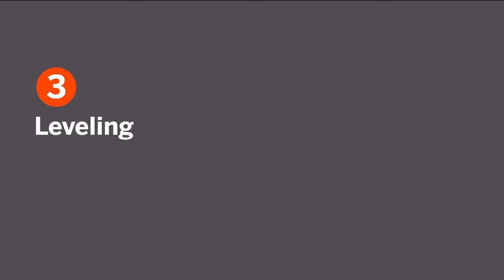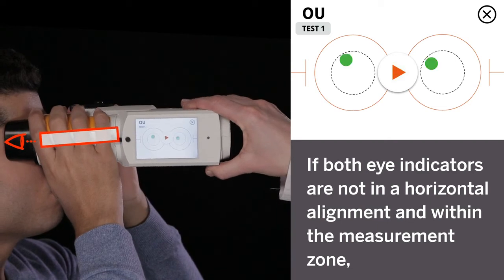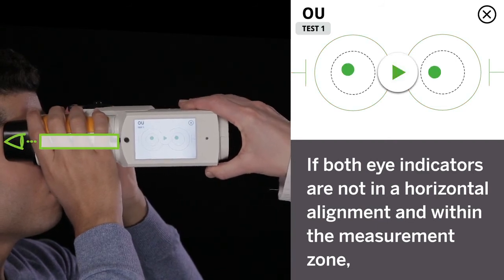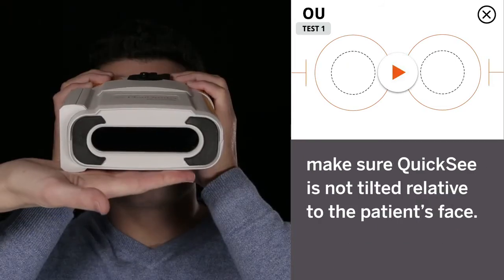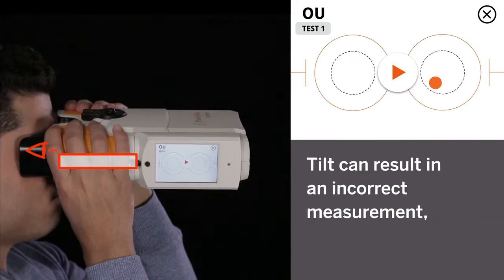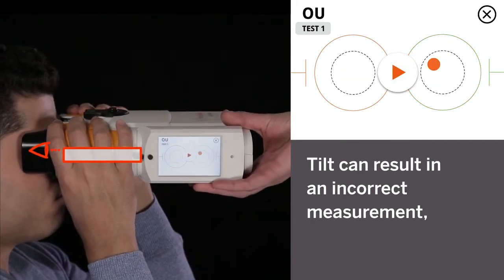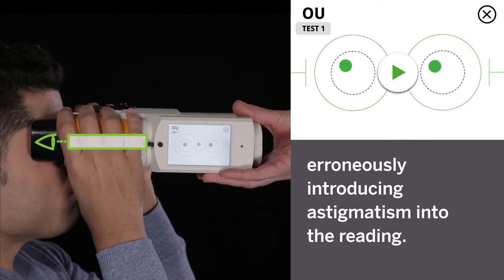Third, leveling. If both eye indicators are not in horizontal alignment and within the measurement zone, make sure QuickSee is not tilted relative to the patient's face. Tilt can result in an incorrect measurement, erroneously introducing astigmatism into the reading.